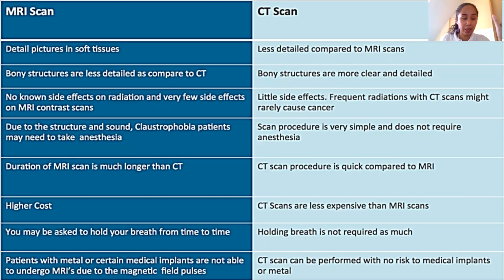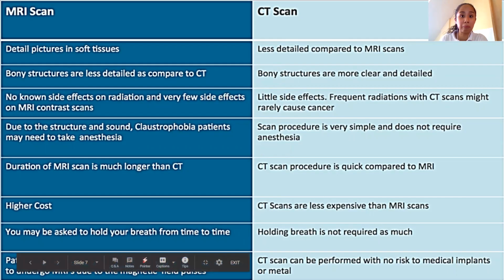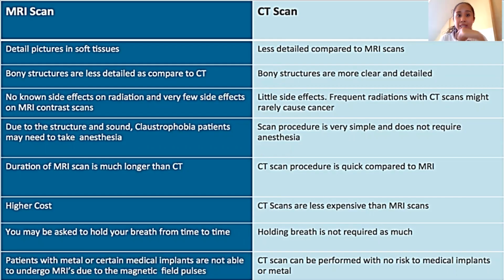MRI is more expensive. MRI, you may be asked to hold your breath from time to time. Yan. CT scan, holding breath is not much required. Patients with metal or certain medical implants, hindi pwedeng mag-MRI kasi nga magnetic field nga eh.